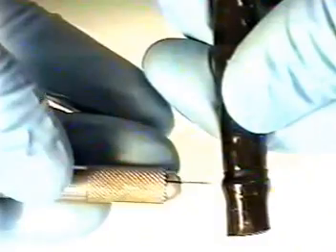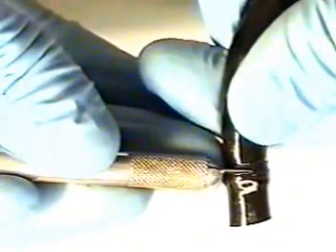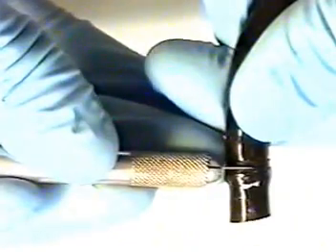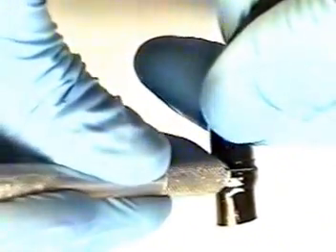Now we will remove the excess bending rubber sheath from the tip of the scope, taking a sharp X-Acto knife, change the blade if necessary. Find the edge of the black silk thread, and at the last binding insert knife blade and cut around distal end or C cover underneath. Cut completely around the distal end hood. We can now pull off excess bending sheath. If it's still attached, carefully cut to totally remove.